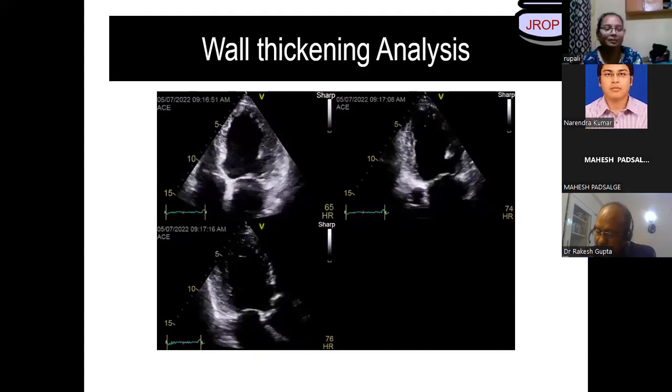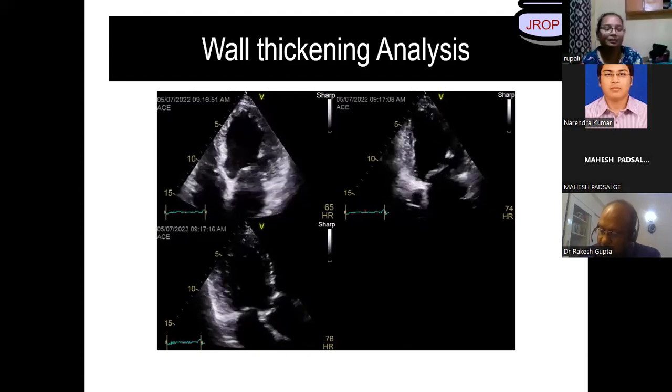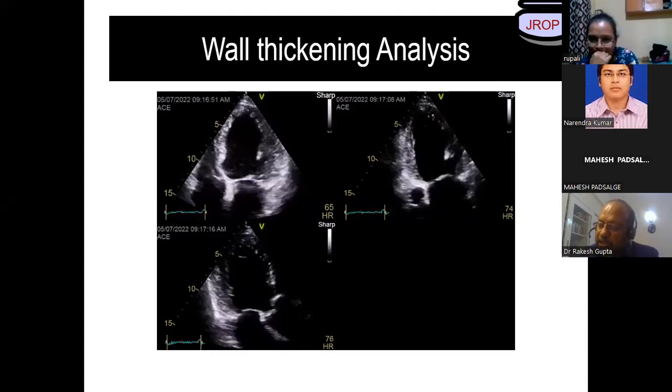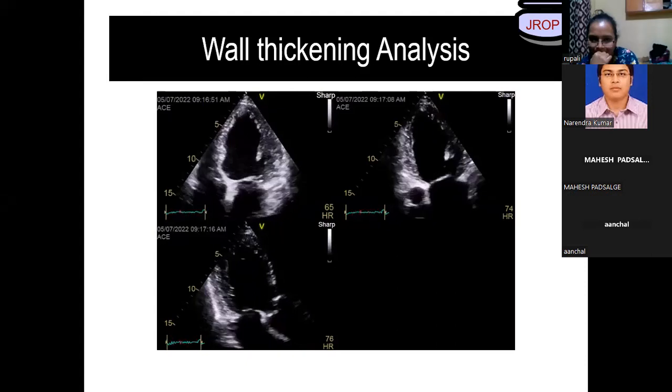Sir, because here aortic valves are seen. Where is the other two chambers? Sir, it is generally not showing because this is the zoomed part. This is not a zoom view. Apart from aorta, anything else which tells you that this is part of apical 5-chamber view?